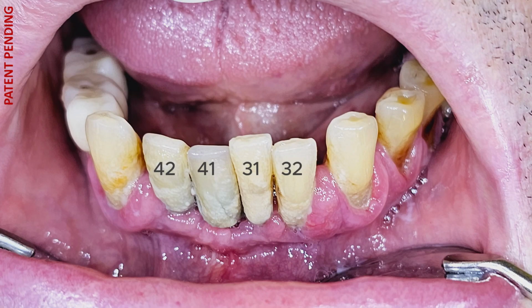The patient, 55 years old, presented with a complaint of mobility of tooth 31. Following clinical evaluation, it was determined that teeth 31 and 32 required extraction. In the area of teeth 41 and 42, the patient had crowns on implants, a composite restoration that had been functioning for approximately 30 years.